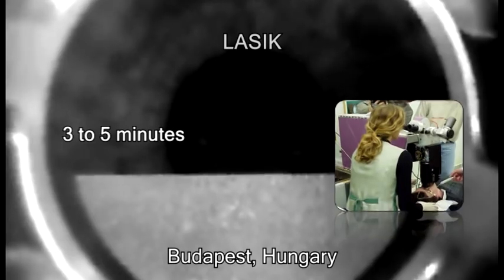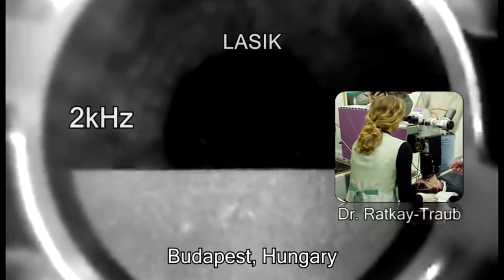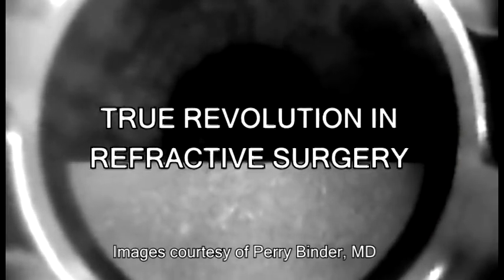First used for a LASIK flap in 1999 in Budapest with a 2 kHz engine, femtosecond lasers started a true revolution in refractive surgery.